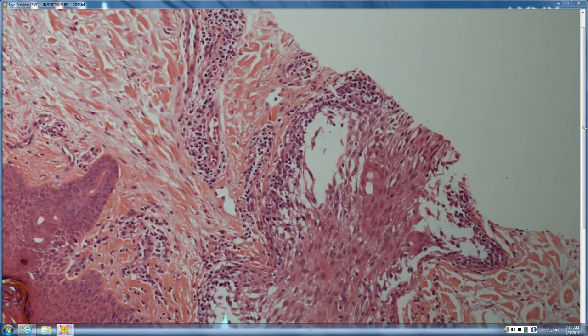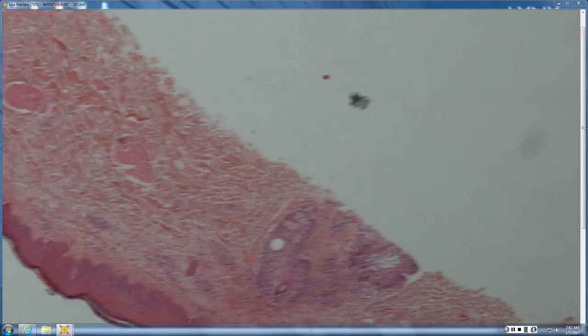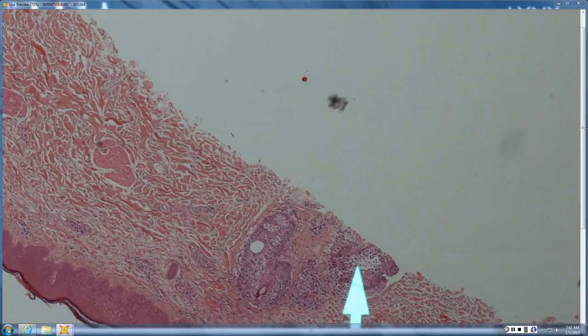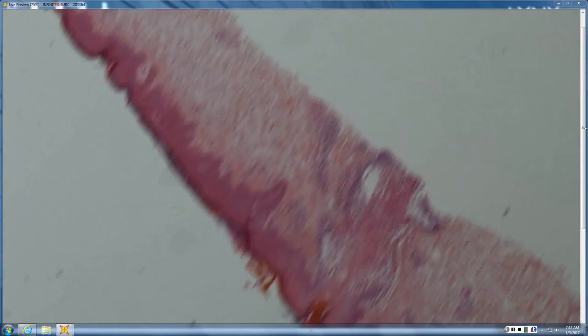Okay. So what do you think about, I mean, you see them around an alopecia areata? I guess it's more around fibrous tract remnants you see. Fibrous tract remnants, where you get EOs pretty deep. Right. This is pretty superficial, right, in the infundibulum. So the question would be, is it just spongiotic folliculitis, or is there something else replacing the follicle? What other clearish stuff could you see in a follicle that tends to go with inflammation? Like mucin? Yeah, like follicular mucinosis.